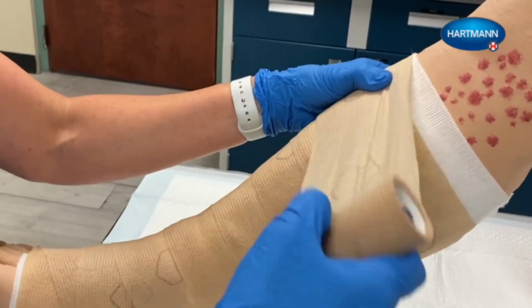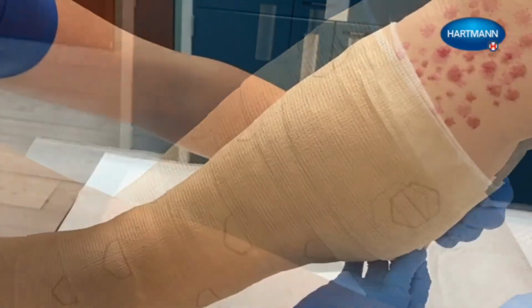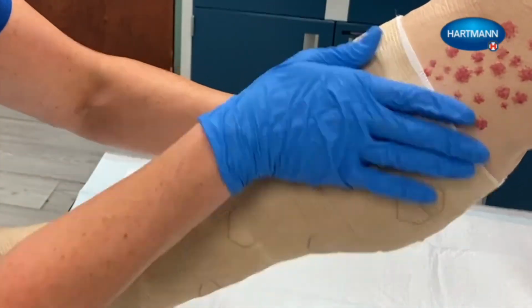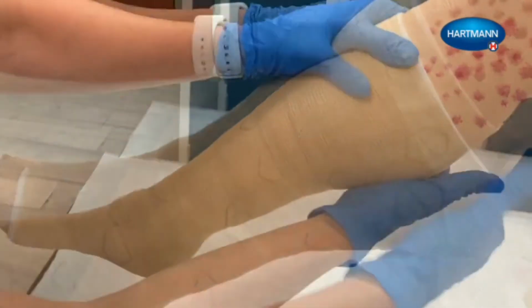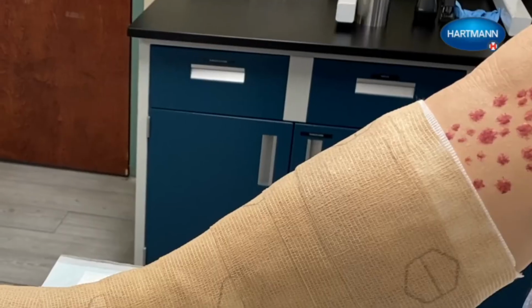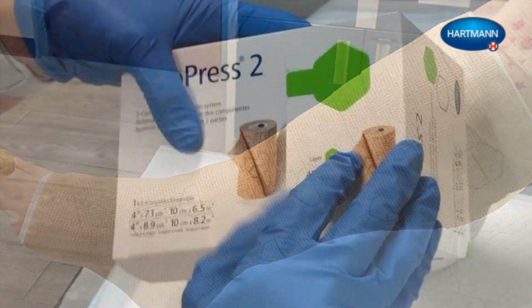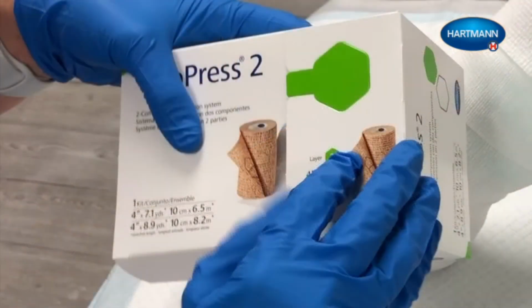Tear off any excess bandage material beneath the tibial tuberosity and about 2 centimeters below the fibular head. Carefully press the bandage onto the entire leg, as this will ensure optimal cohesion. Additional fixation is not necessary. Tape can be used if required. Check the elongation using the template found on the flap of the packaging.